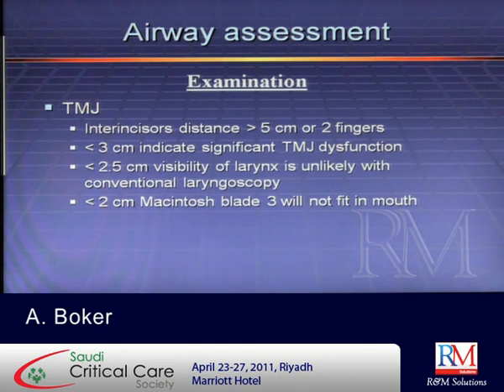Laryngoscope. So laryngoscope will not fit. So laryngoscope is out. I think you better know what it is. Okay, that's the reason. So what other information is very useful? Sorry? So you could think of using the nose.